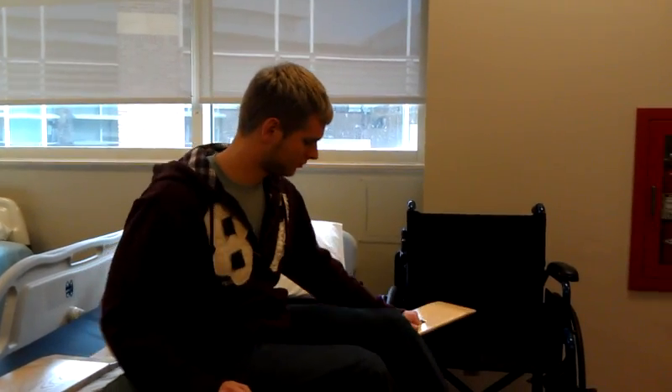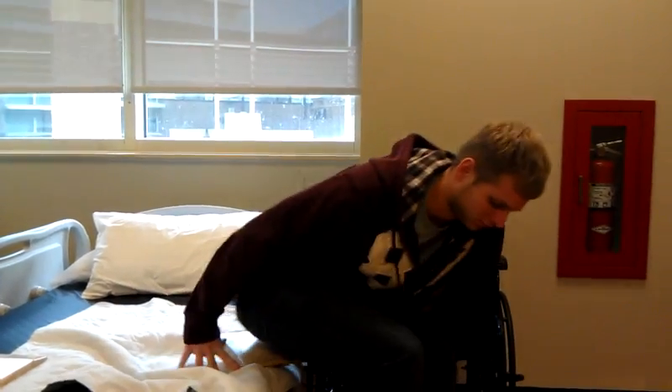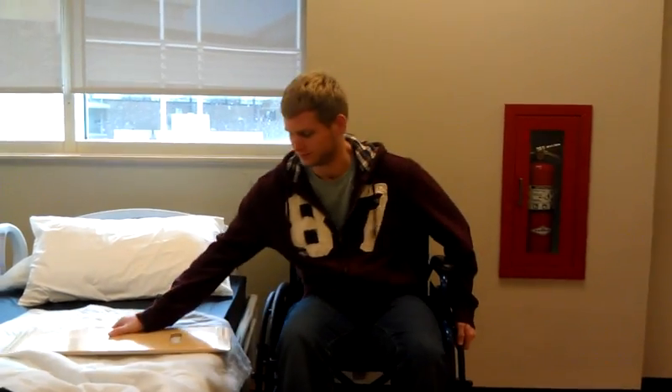He will now transfer back into the wheelchair. This has been a demonstration of how to safely transfer from wheelchair to bed.